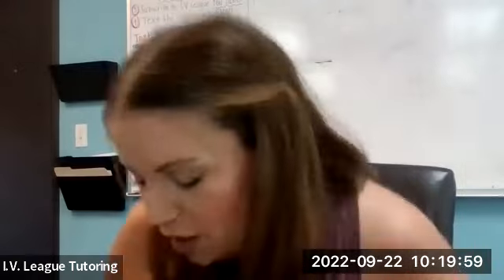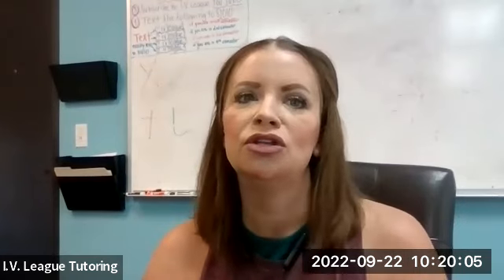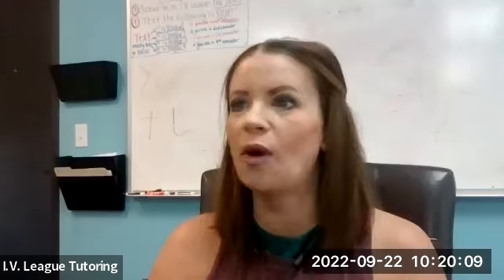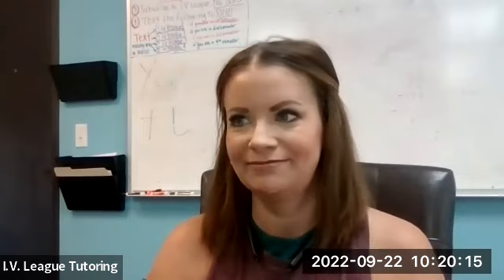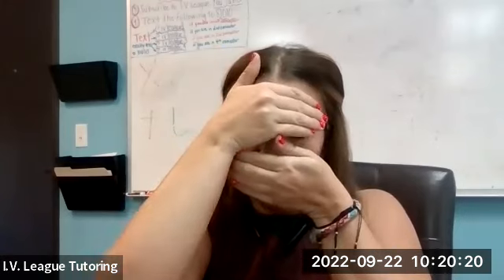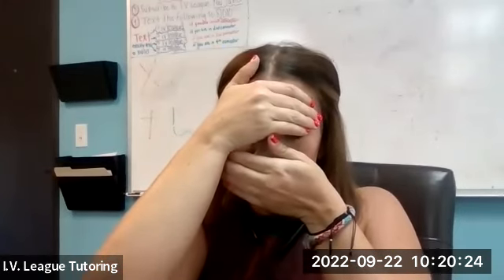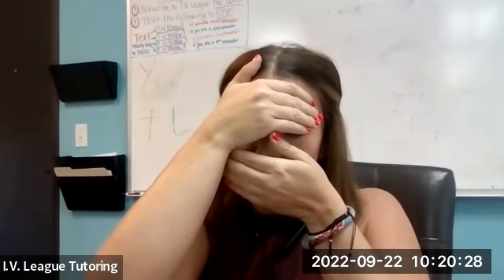All right. So the P wave represents atrial depolarization, which means the atria is doing something. What does a QRS complex represent? Ventricular. Ventricular what? Contraction? Let's use the big girl words. Repolarization. Quit looking at my face. That's what y'all are trying to do, is look at my face. The QRS complex represents... Did y'all not hear me because my mouth is covered?